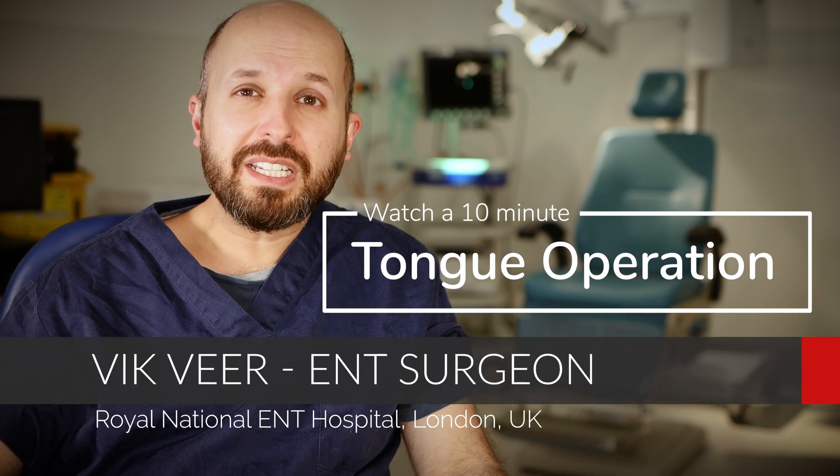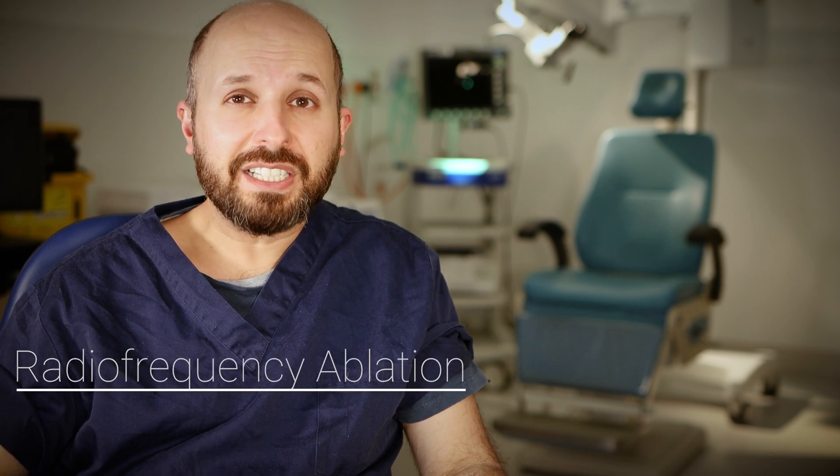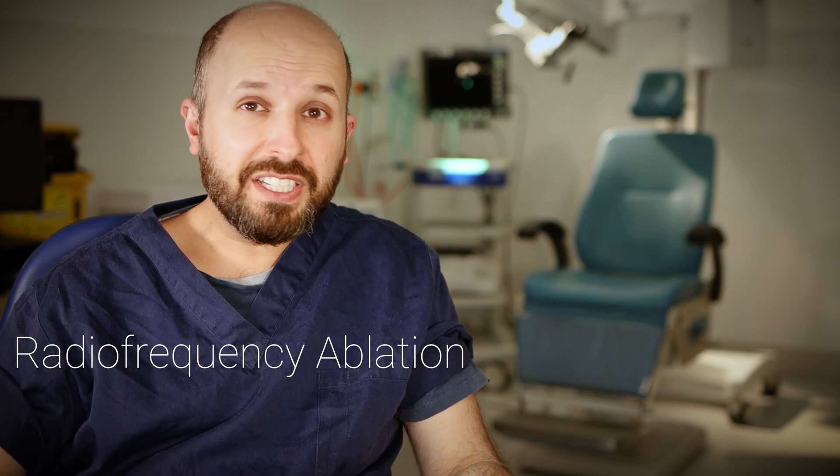Hi there, my name is Vic Veer. I'm an ENT consultant surgeon working for the National Health Service in central London. Today I want to tell you all about radiofrequency ablation to the tongue base. I'll show you a video and explain why we use it, explain what it is and how it works, and I'll show you before and after pictures as well.